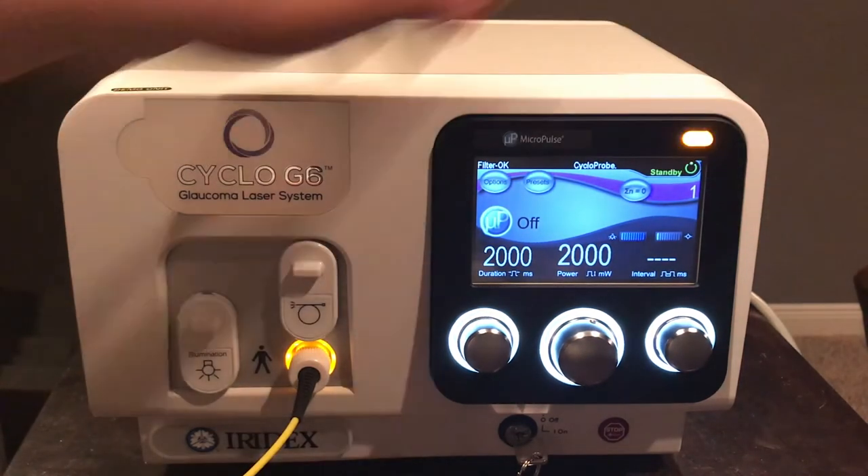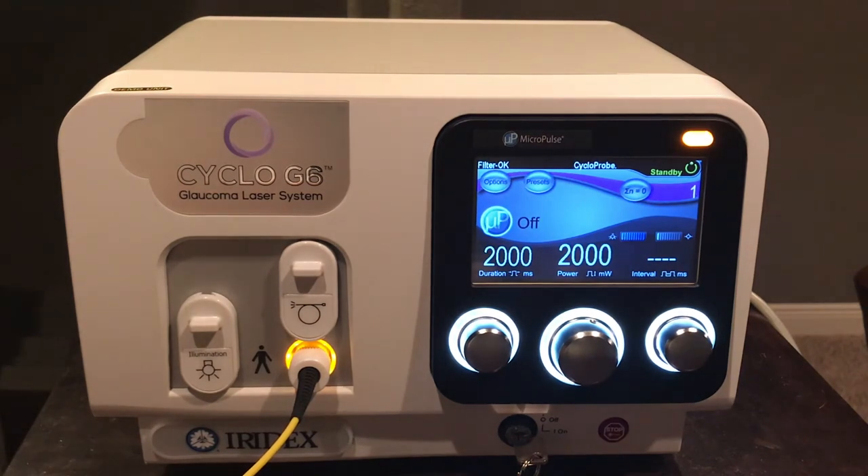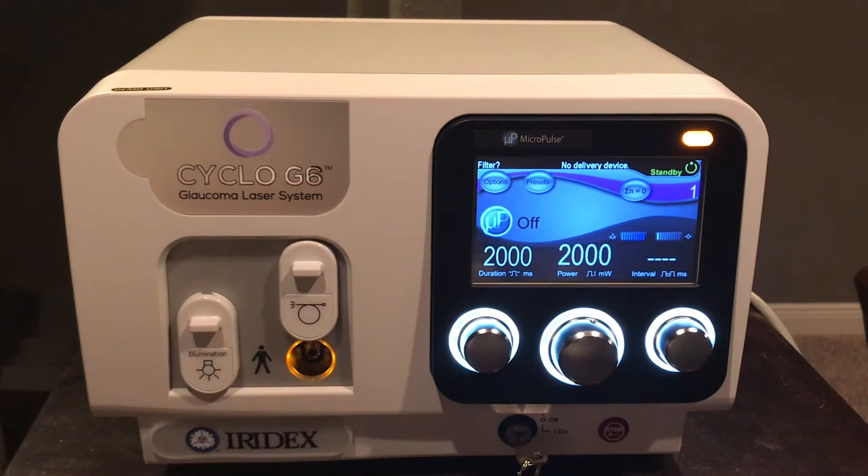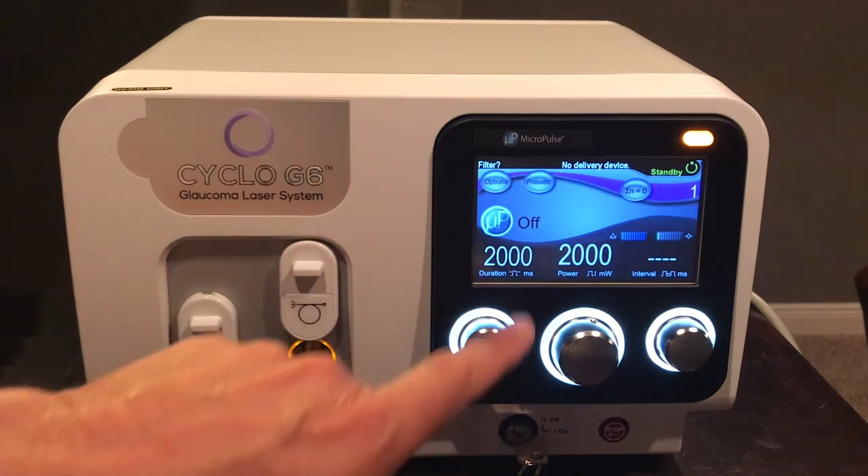When done with the treatment, disengage the laser — no energy will be delivered through the fiber. You can then disengage the fiber from the laser. These are single disposable-use devices, FDA-labeled, and come in a sterile double-pack package — discard after the procedure. They are suitable for a bilateral or unilateral procedure on a single patient, but are not for multiple use. No cleaning or sterilization can be performed once the package has been opened and the device used on a patient.